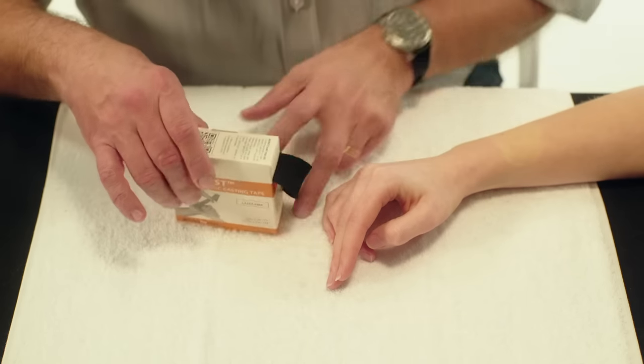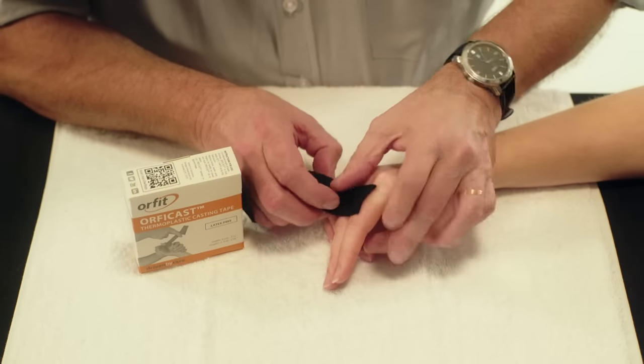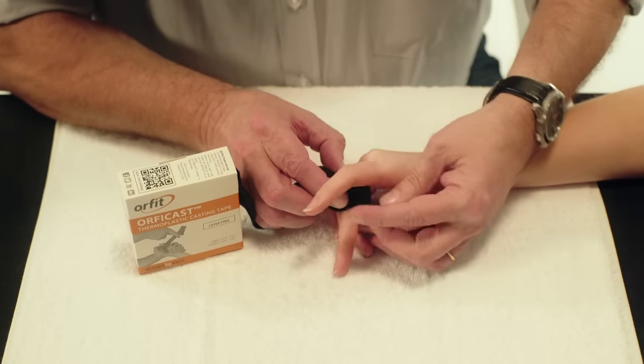Use two strips of 3 cm Orphicast, each measuring two times the circumference of one of the fingers.